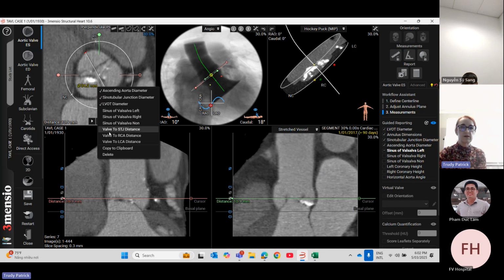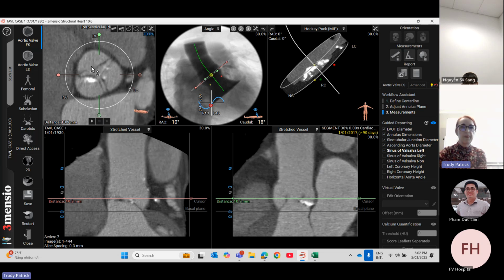Just take this one. So I'm going to do this one. Okay. Yeah. It's a bit more tricky.